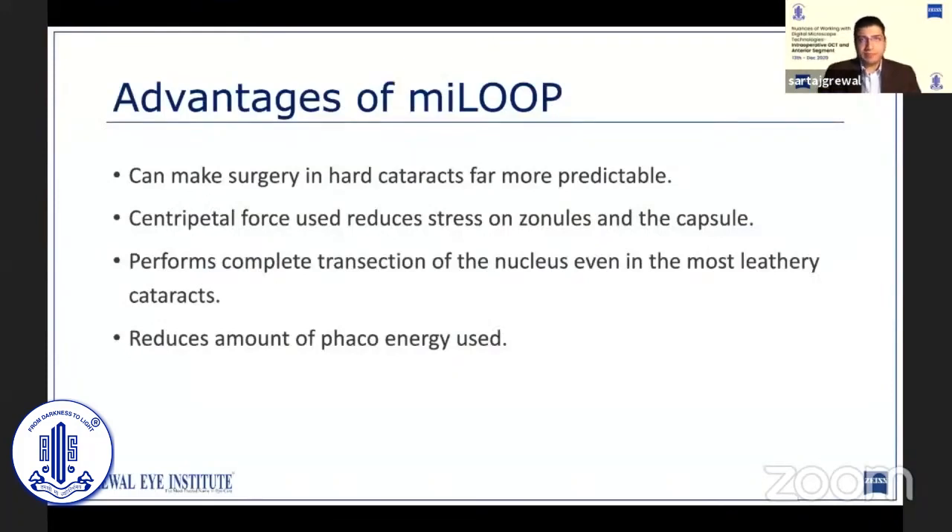In my experience, the best part about the MyLoop has been that it has made surgery in these very dense cataracts far more predictable. I myself was very hesitant using it the first time. I was not sure how much force would be required to retract the filament and divide the nucleus. I remember being completely shocked when it just cut through it like a warm knife through butter. There was nearly no perceivable resistance at the time of retraction. Even though it appears quite traumatic in the video, I have never experienced a compromised capsule or zonular support in any case so far.